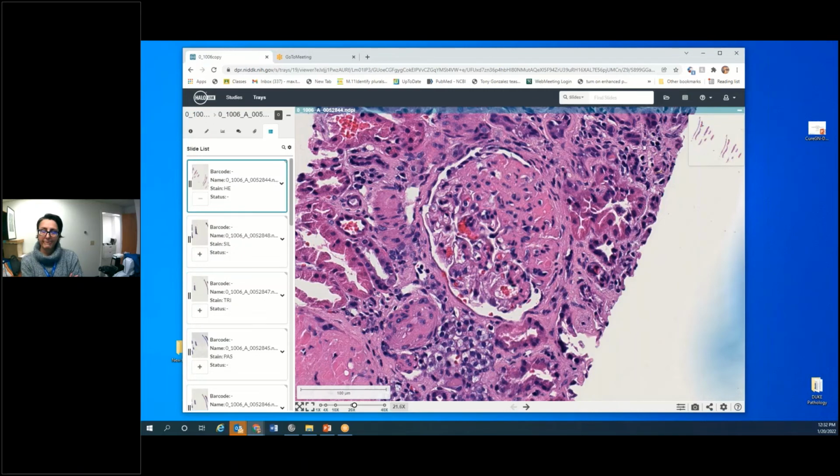So in other words, you want to have the DPR open and the CRF open at the same time, so you can just copy and paste the actual URL link, and it will take you exactly to that. It's a much more elegant solution, and you don't have to put anything on the slide. That means we all need to be justified in having two giant, big, beautiful screens to work with, right?